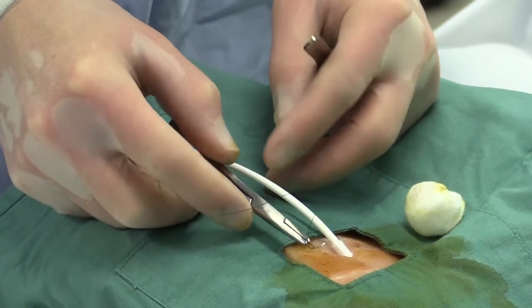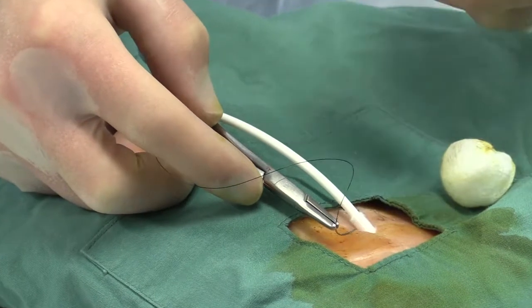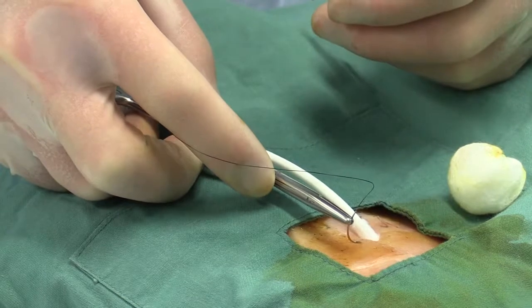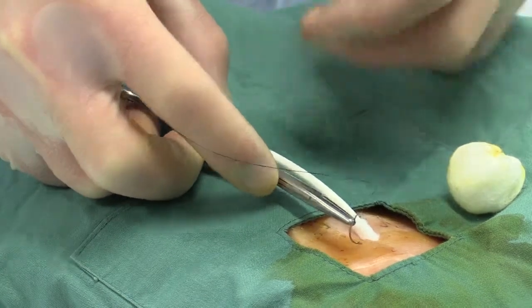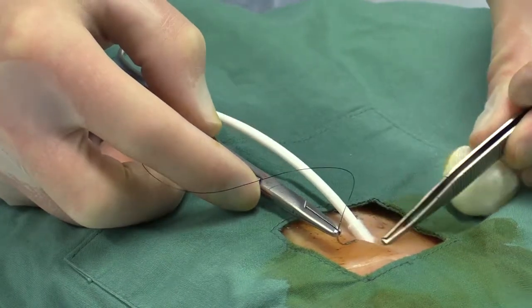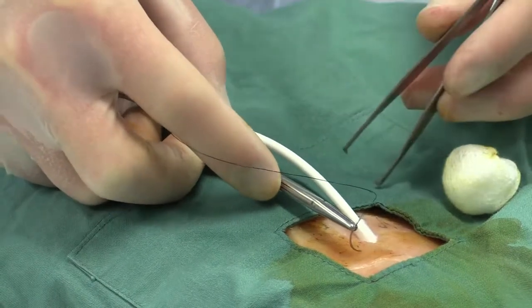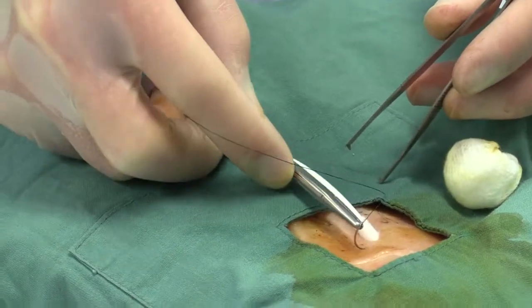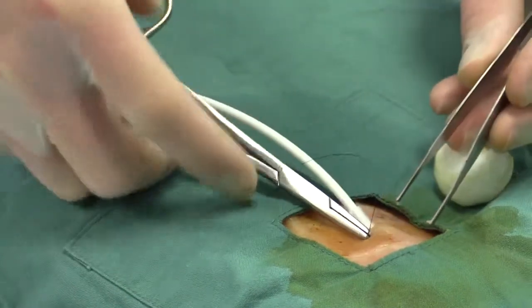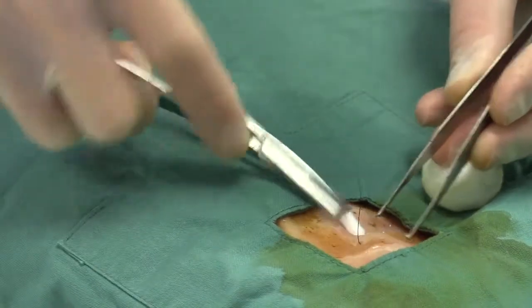And by purse string, I mean a circular suture, which will act both as a securing mechanism as well as a circumferential cerclage in order to create more of a watertight seal. It's important at this point to know that the catheter traverses inferiorly and not to puncture the catheter on your passage through the subcutaneous fat. So nice wide stitch deeply into the fat without puncturing the catheter on your way across the anterior inferior surface.